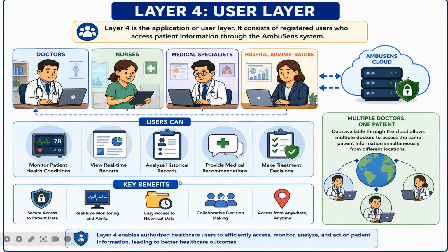Now here the healthcare professionals can provide medical recommendations based on the analyzed data and make appropriate treatment decisions. Access to comprehensive patient information enables doctors and specialists to offer better diagnosis and personalized healthcare services.